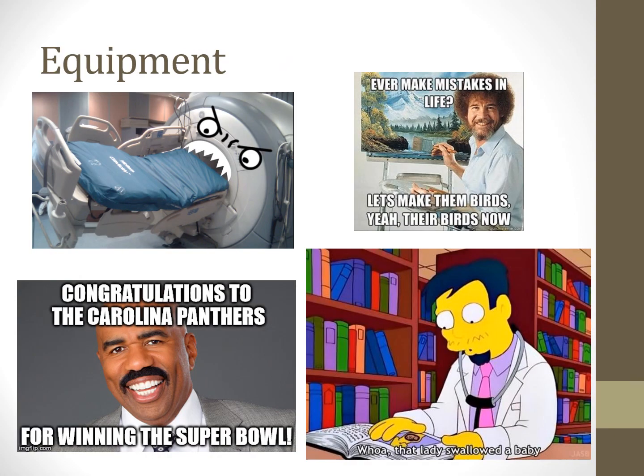And finally, equipment. Equipment can fail. They're just machines, right? Every once in a while, equipment can fail. And like I gave you that scenario about the baby in the NICU where it was just that little port left open, you just got to be aware of those situations, and hopefully you just take them off and ventilate them by hand and then change out the machine, right?